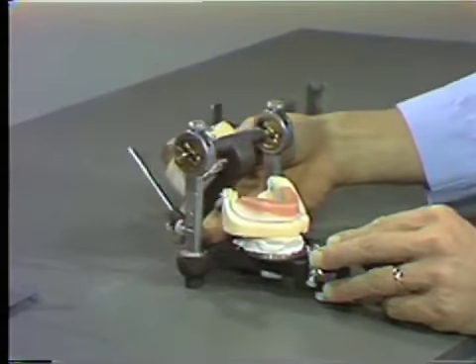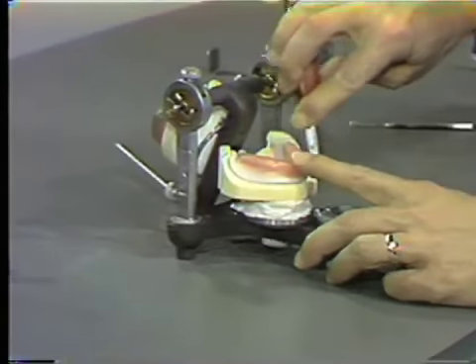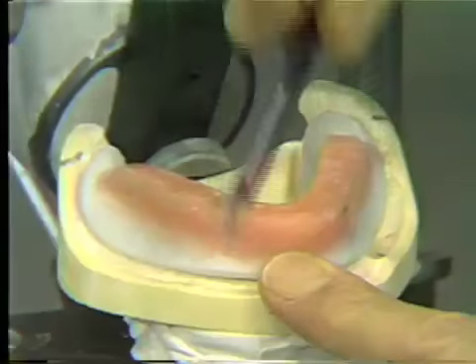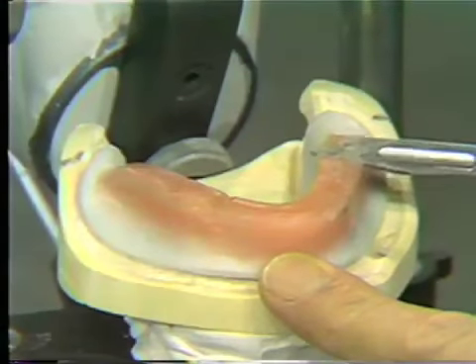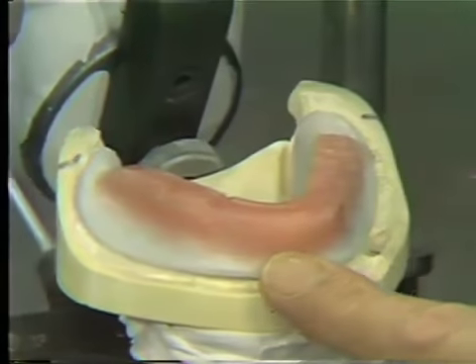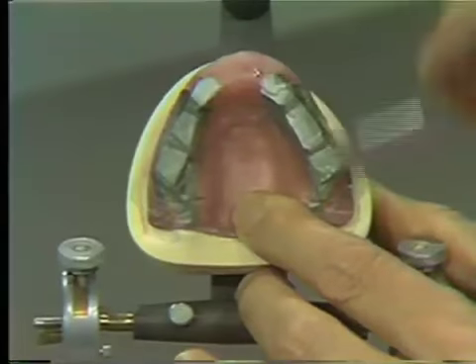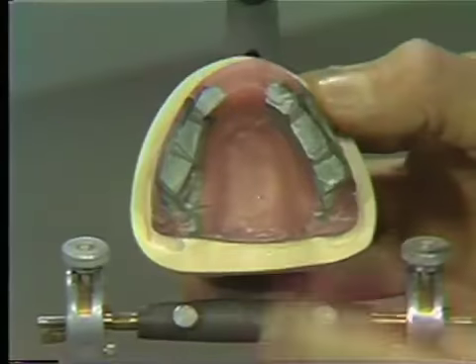We now can see that our lower rim came apart rather nicely. If we do have excess wax on there, we will remove it. On both sides, we'll sharpen our grooves, make sure that they are very sharp, definite grooves again. And when we go to the patient, we will replace all the soft wax on the upper rim with new wax and record from the patient a new wax relationship.